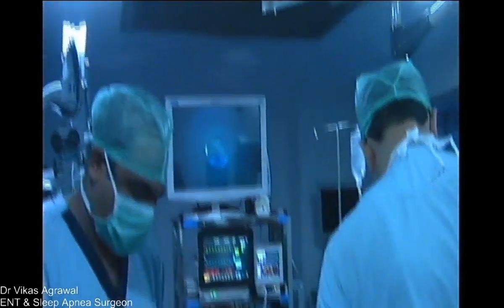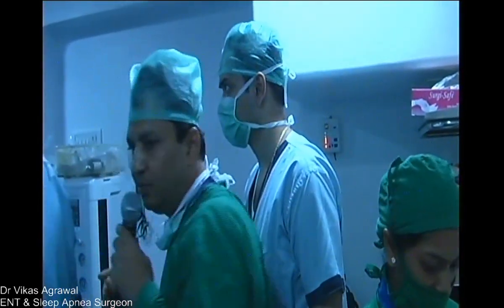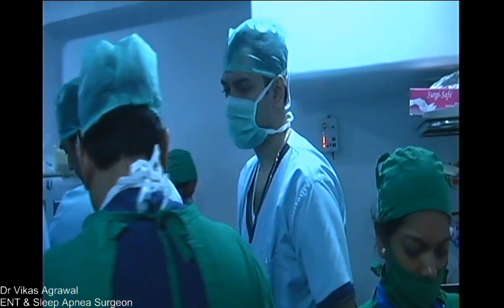No bleeding. Now Rahul will talk to you, I'll go to wash up. So first palate, now we'll do first the palatal surgery and then the tongue base surgery, so that we create more space at the palatal wall.